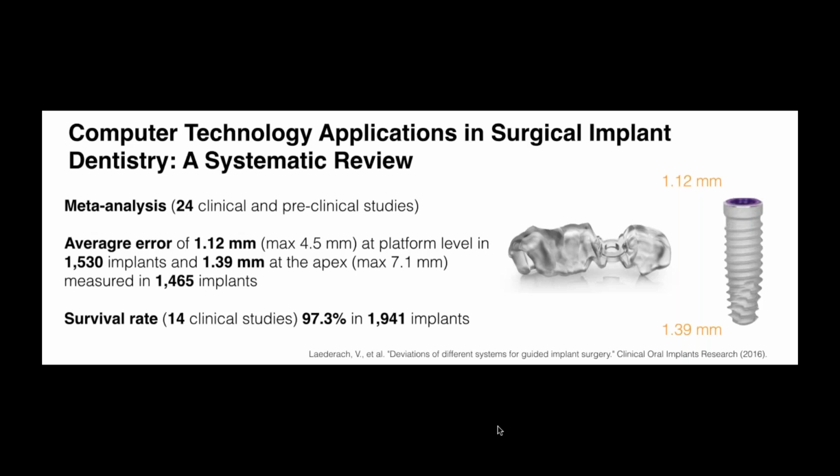And the reason for this is that if we first plan the prosthetics and then we look for a good foundation for these prosthetics with ideal implant position, length, width, etc., angulation, those restorations tend to last longer. Okay, so we got to start going from the wax-up and then going for a great foundation, and then we move for the ideal material for those final restorations.